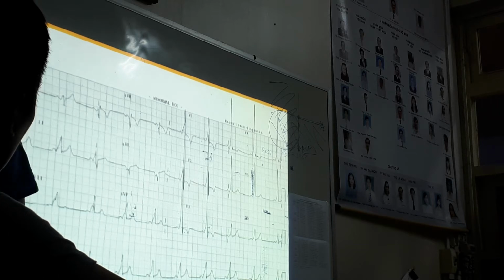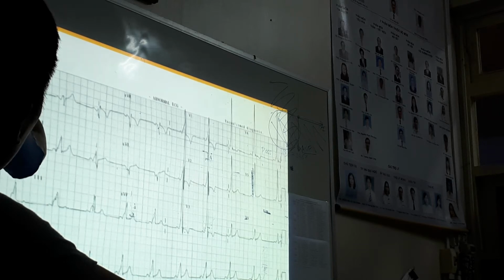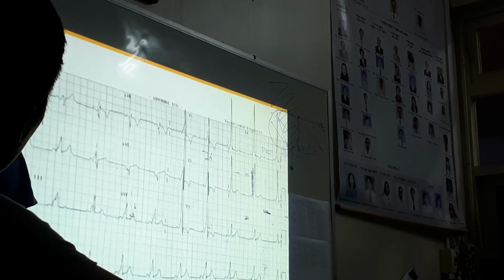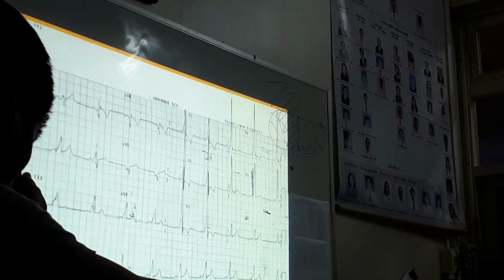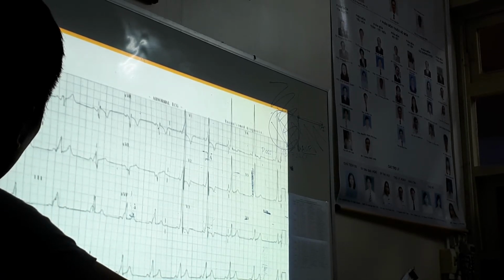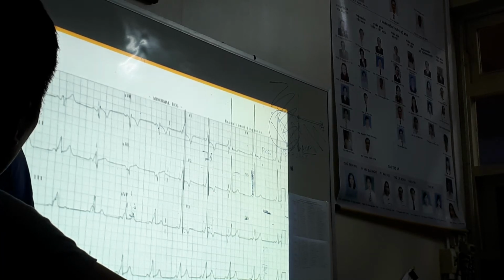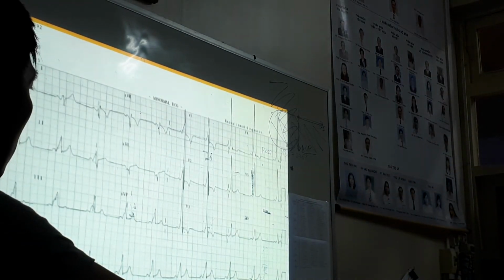With Wolff-Parkinson-White, you have an accessory pathway, bundle of Kent, and you have a signal, but the signal goes directly through. Okay, you don't have this block at the AV node. So you'll have your QRS, and you'll see this instead. And that's why you have a delta wave, and you have the short PR interval there. Okay? We could do more about Wolff-Parkinson-White, but I think it's too much. That's a whole lecture by itself.